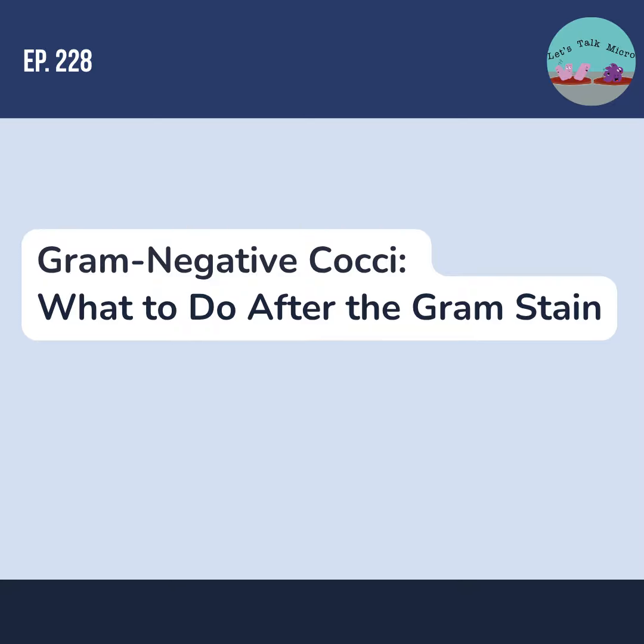typically in the form of a disc or a broth, and you incubate it at 35 to 37 degrees in ambient air for 4 hours. The test is then observed for a color change. A yellow color indicates a positive result, while no color change indicates a negative result. So keep that in mind, and thank you for bearing with me as I pronounce that whole name. I appreciate it.